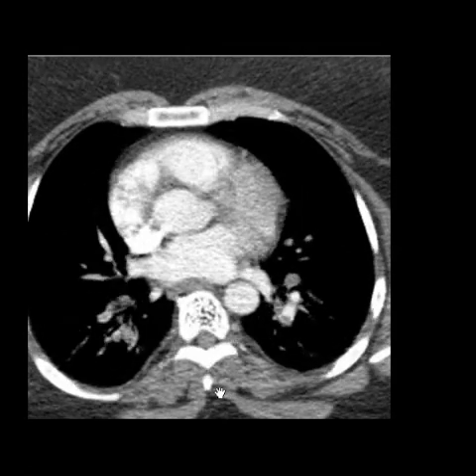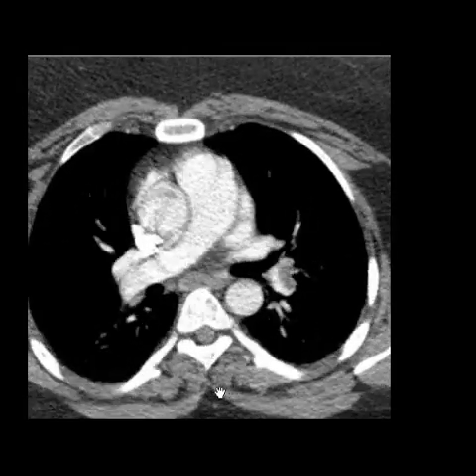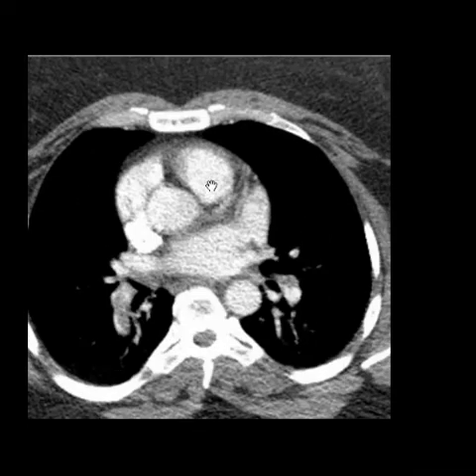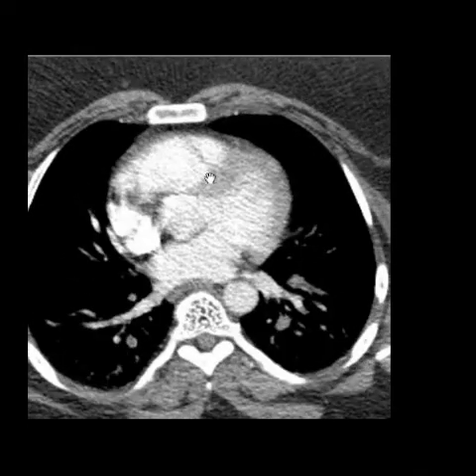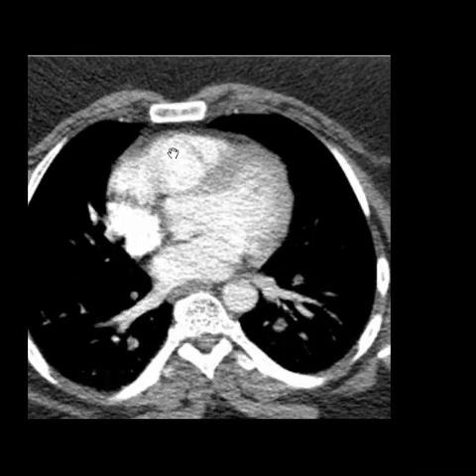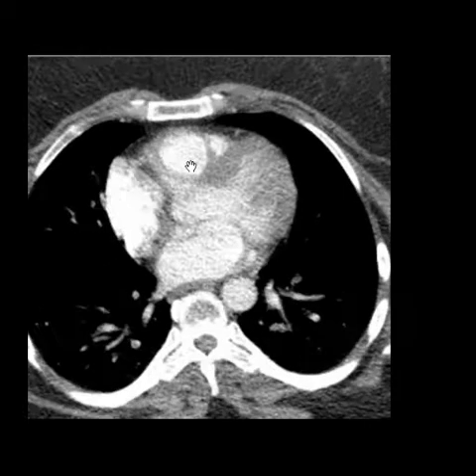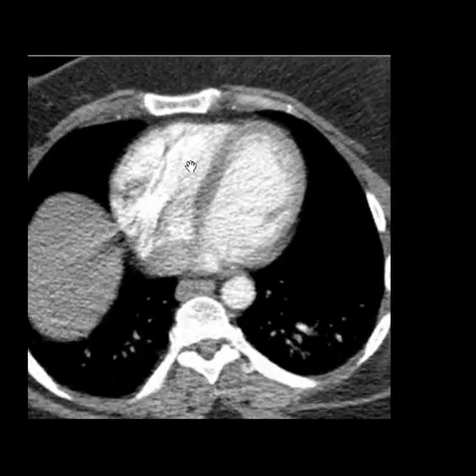Let's go up to the mediastinum here, the superior mediastinum. This is the main pulmonary artery, and if we follow it back down, we'll see that it comes out of the right ventricle. Right atrium, right ventricle. Left atrium, left ventricle. The right ventricle is pumping deoxygenated blood to the lungs so it will become oxygenated.